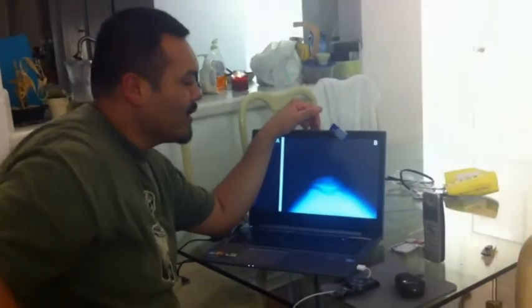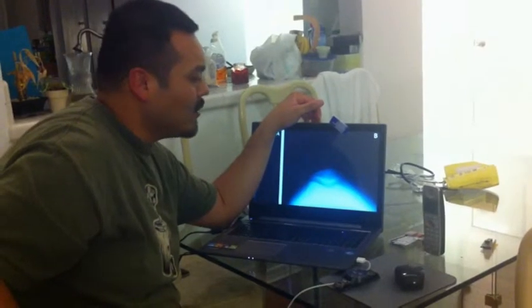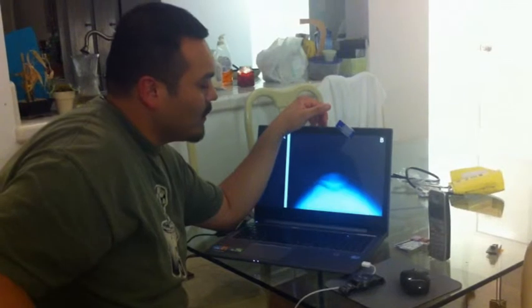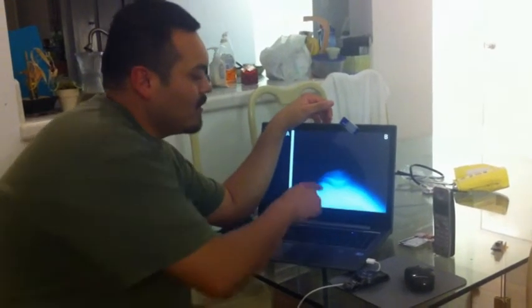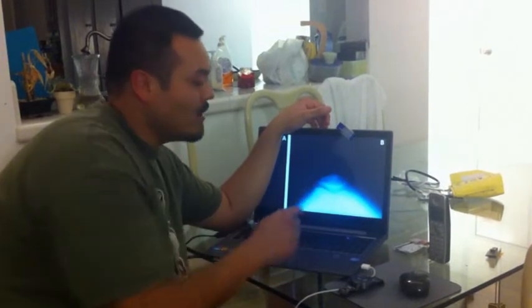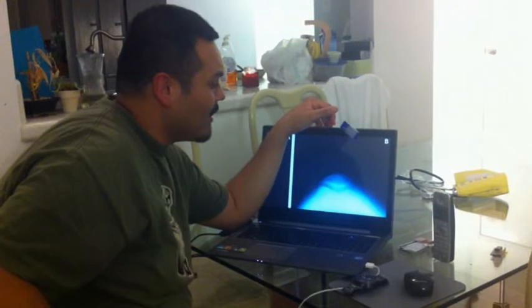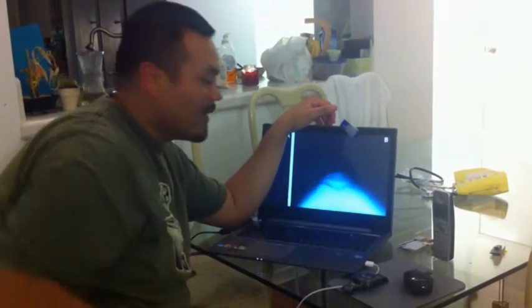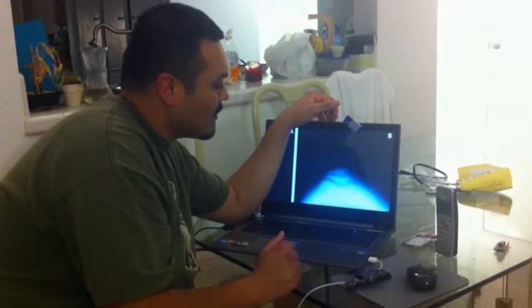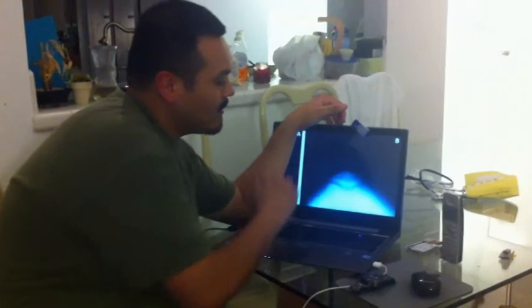Alright, so now we're back and we're going to take a look at our tangential patella, which was our Settegast method that we did, our sunrise. With this one, you want to see the nice patellofemoral joint space open here and your patella free of superimposition from anything. So it's pretty much just floating all in space by itself. You got your condyles here, which is nice on your femur, and your patella is nice and floating by itself.